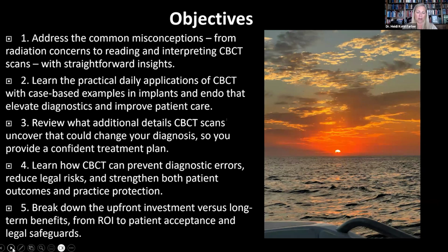So there's my caveat. The objectives for tonight were very lofty objectives. Address the common misconceptions from radiation concerns to reading and interpreting CBCT scans, and learn practical daily applications of CBCT. For this course today, we limited that to implants and endo because there's a wide variety of areas you can use your CBCT in. Review what additional detail CBCT scans uncover that can change your diagnosis.